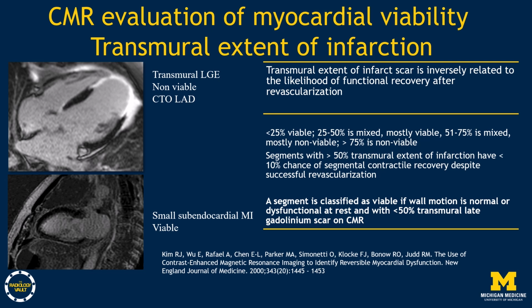In clinical practice, a segment is classified as viable if wall motion is normal, or dysfunctional at rest with less than 50% transmural late gadolinium enhancement or scar on cardiac MR.